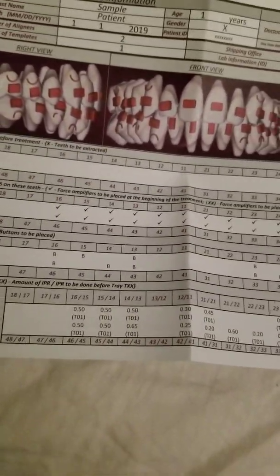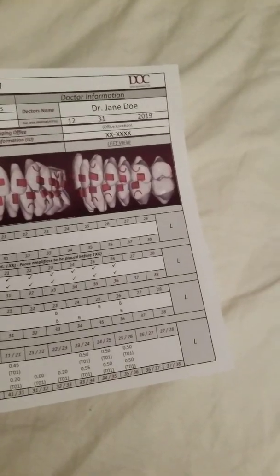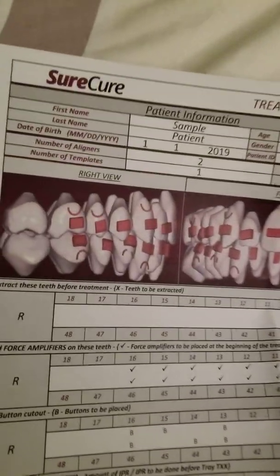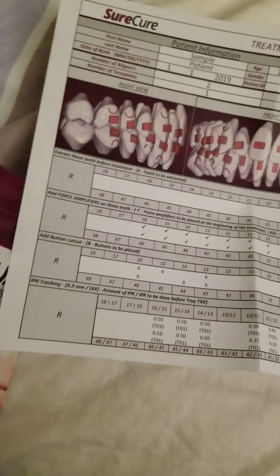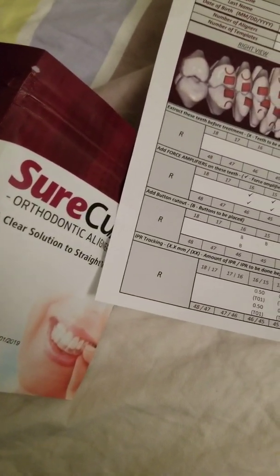I don't know what that means either. So this is good. If I see this and I tell them I don't know what stuff is, they might want to redo this. Okay. If you want to add buttons, here they're showing you that they had buttons added. Oh, so yeah, the force amplifiers are the attachments. Okay, that's easy. So this is where they wanted to add. That's a heck of a lot of buttons. That's pretty crazy. I don't think I'd like that. That's all kinds of mouse traps in your mouth. Okay, anyways, but at least you know it's possible.